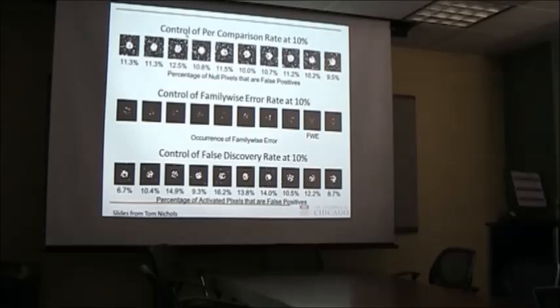If you're going to set some threshold, you're going to say, well, I have all these values at each voxel, and I'm going to set some threshold of what I'm going to call significant, without really doing any correction. You might get something like this. So now your image is what we call binarized: you call it either significant or not. In this case, significant will mean a little white dot and black will be non-significant.